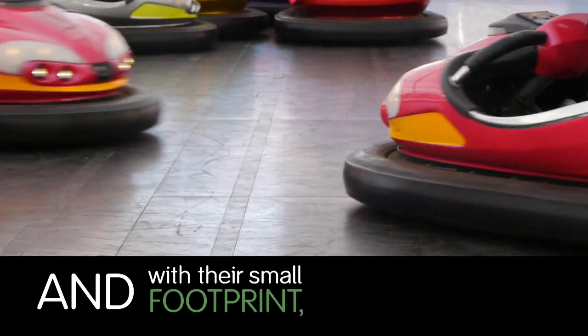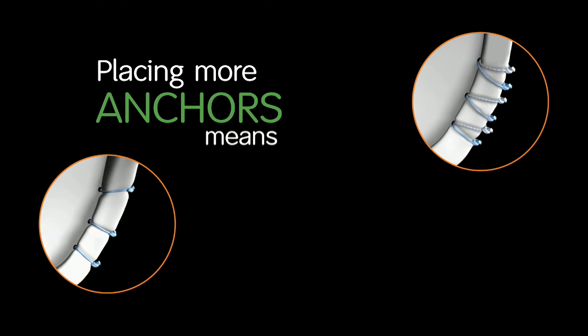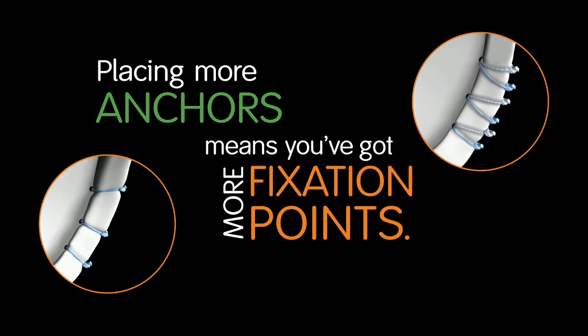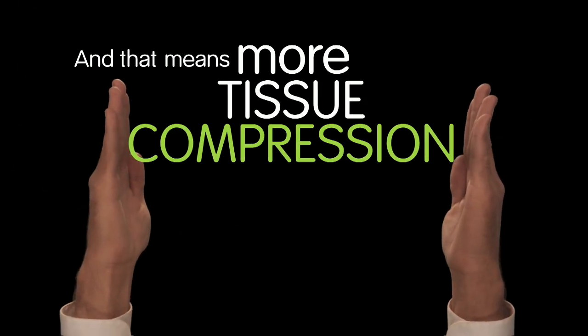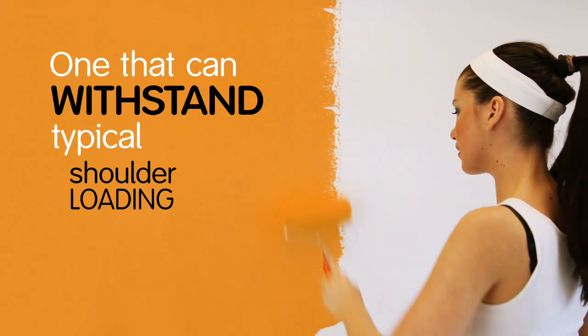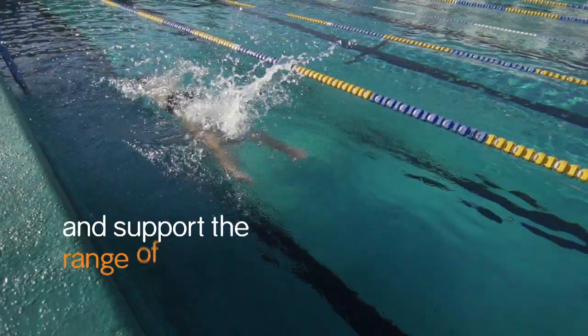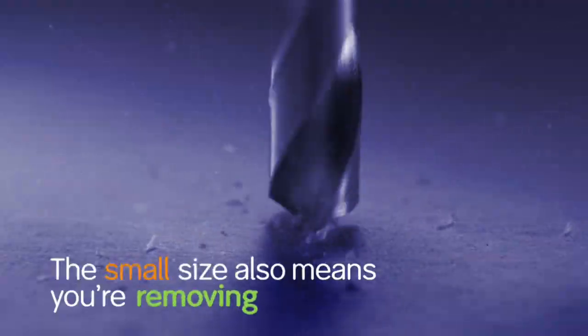And with their small footprint, they won't bump into each other. Placing more anchors means you've got more fixation points. And that means more tissue compression for a secure repair. One that can withstand typical shoulder loading forces and support the range of motion necessary for healing. The small size also means you're removing less bone.